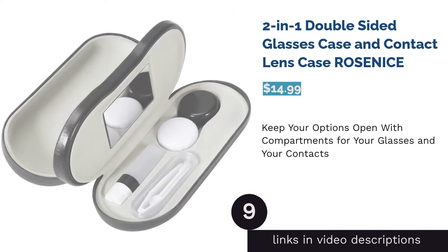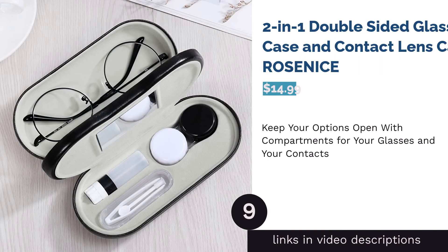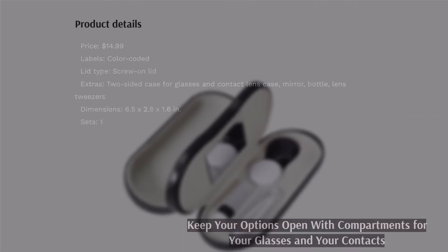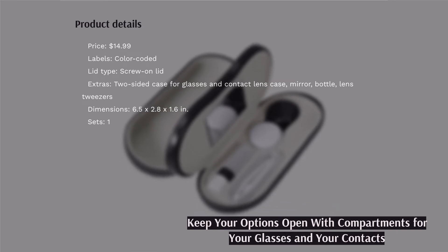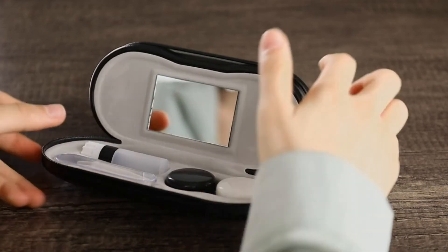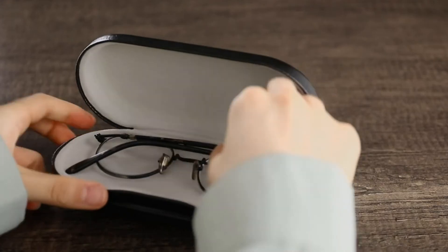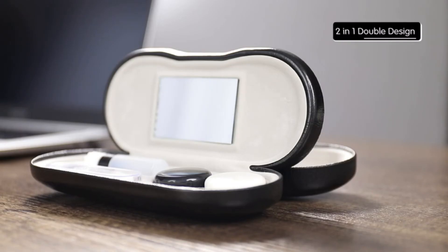The next product in our list is the 2-in-1 Double-Sided Glasses Case and Contact Lens Case by Rose Nice. This multifunctional case doesn't just hold your contact lenses — it also has a compartment for your glasses. For people on the go, this case will come in handy since it keeps your glasses and contacts in the same place, so if you need to do a quick switch, it's no problem.